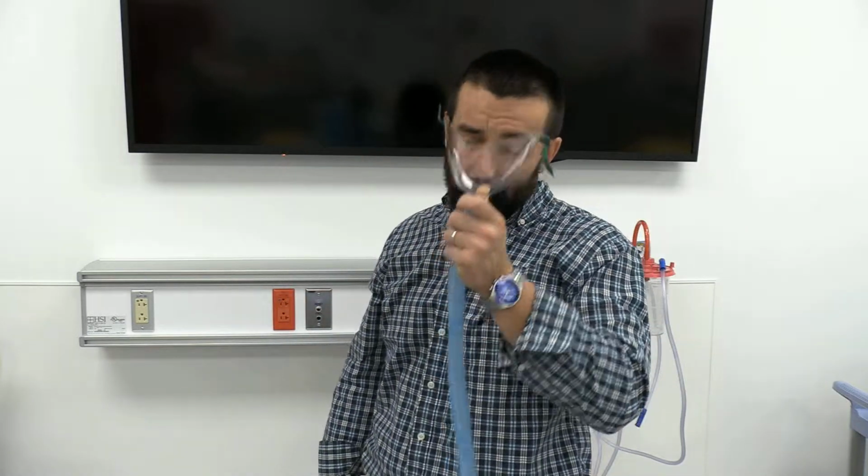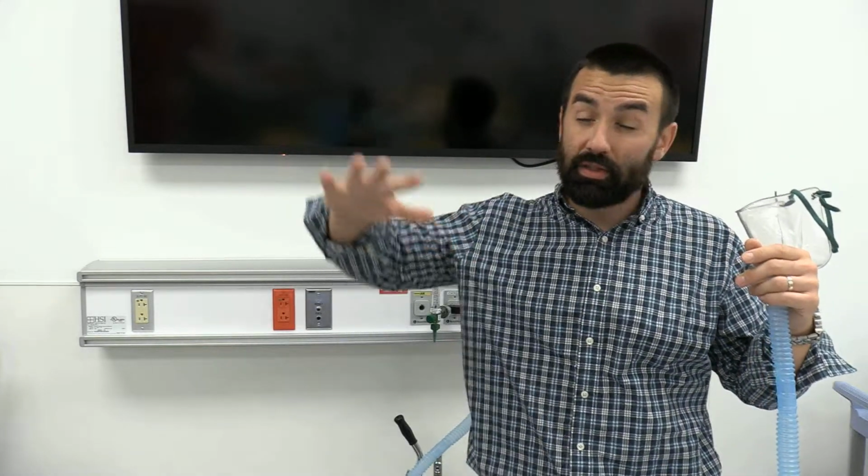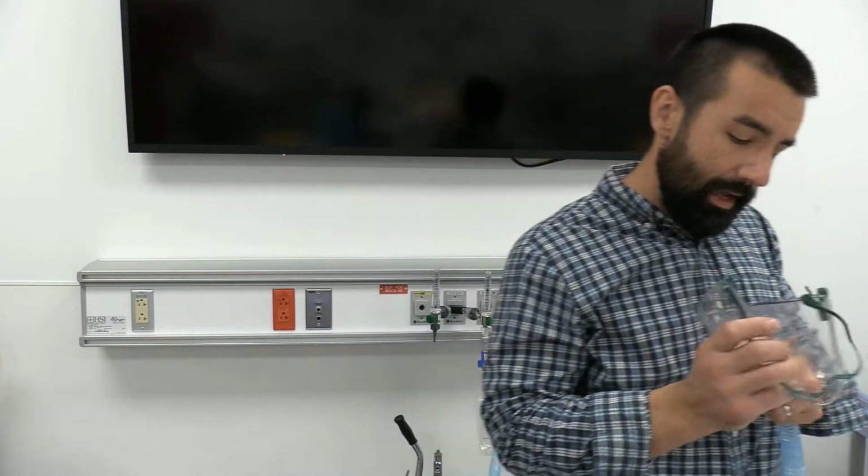So when you show up and you see a patient in a situation, I'm trying to look at that aerosol. If you don't see enough aerosol coming out of there and it completely disappears on peak inspiration, it means you are not providing more flow than what they're taking in. And in that moment in time, the rest of the gas they're taking in is from room air, so they're actually diluting down what you think you're giving them, and it's no longer high flow. So very, very important. Sometimes it's difficult to see depending on the lighting in your room and things like that, but you get a visual to kind of link up with these concepts, okay?